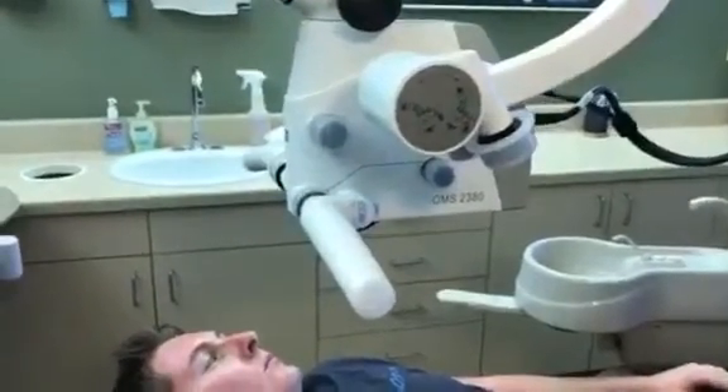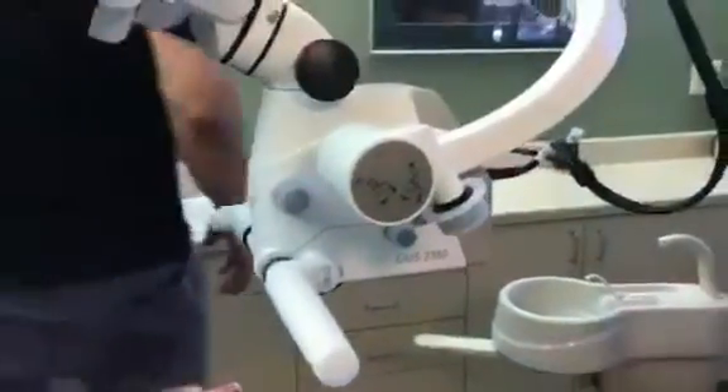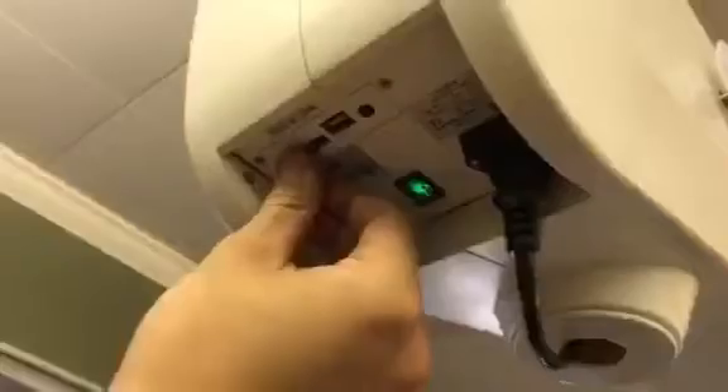Where is it saving stuff? SD card. There's an SD card right here in the bottom of the microscope. It's a push-pin, so you push it in to remove it, put it in the computer, and you can save it to your patient chart.